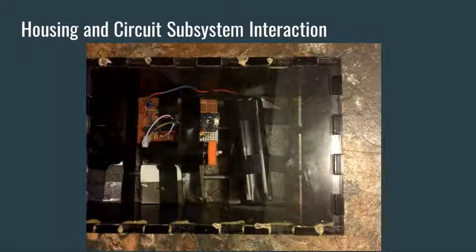This electrical tape also serves as a protective safety feature for the patient, so that if the circuit subsystem was to come loose, there would be no concern of any of the electrical components touching the metal and causing discomfort for the patient, due to the buffer that the electrical tape serves. And although there is a plastic cover between the metal expander and the circuit subsystem, this is just another extra precaution to ensure that the patient is not injured or experiences any discomfort due to the circuit subsystem.